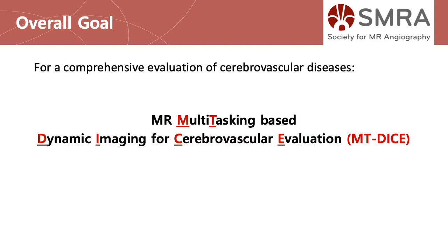So in this work, we propose an MR multitasking-based dynamic imaging for cerebrovascular evaluation technique that provides DCE and leakage-corrected DSC-MRI information simultaneously with one 7-minute scan and injection of a single dose of contrast agent.